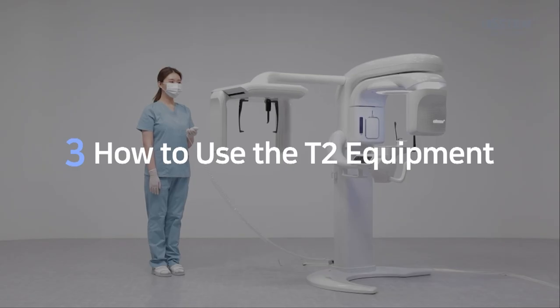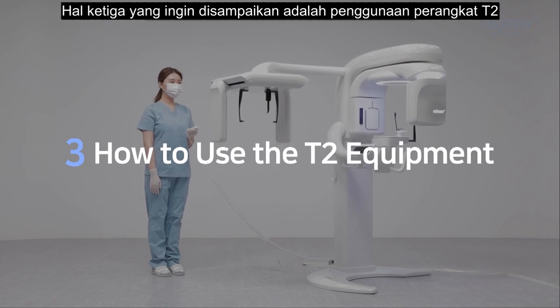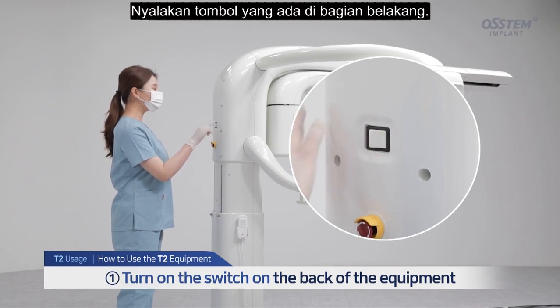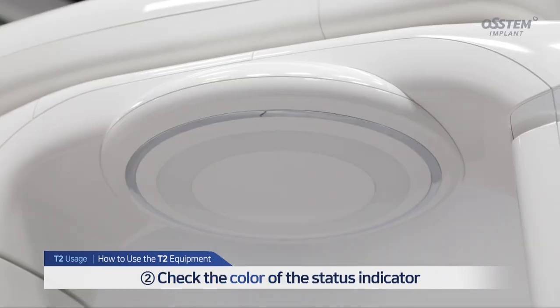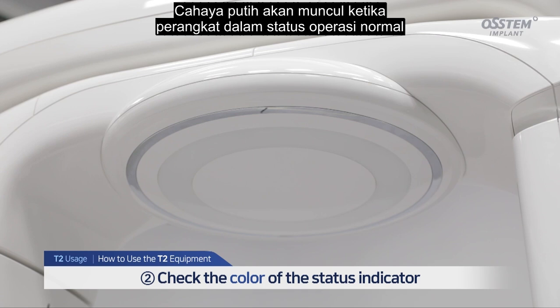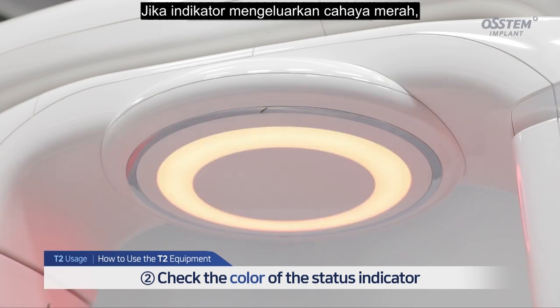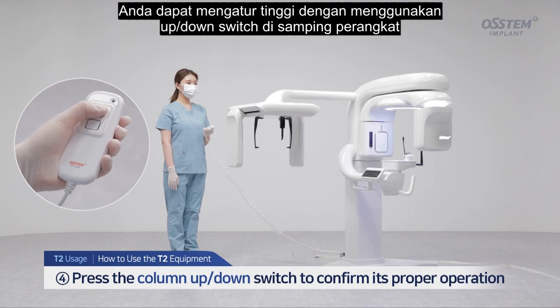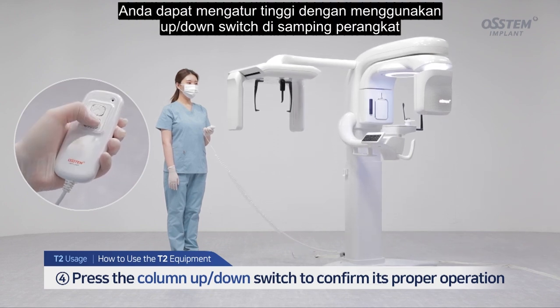The third thing I'd like to explain is using the T2 equipment. Turn on the switch located on the back of the equipment. A white light illuminates when the equipment is in normal operation status. If the status indicator is illuminated red, turn the emergency switch on the back of the equipment clockwise to turn it off. You can adjust the height using the up-down switch on the side of the equipment.